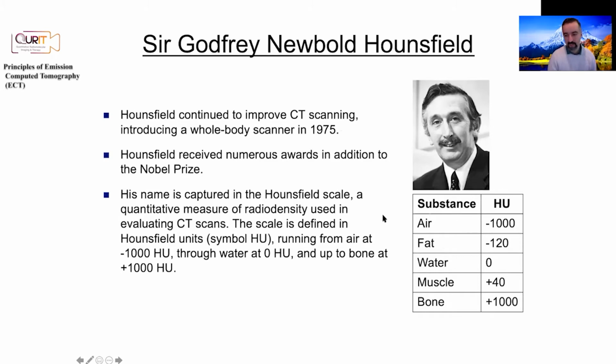And these are very important numbers, reference numbers. For example, -1,000 Hounsfield units represents air. So in the scale of Hounsfield units used in the context of CT imaging, these are the kind of numbers that you typically have, especially the -1,000 and the 0, and then you move on to bone, etc.